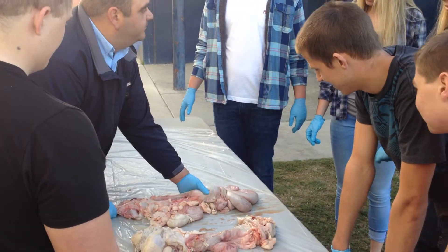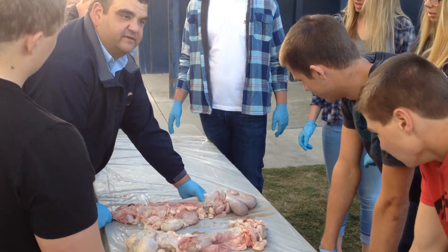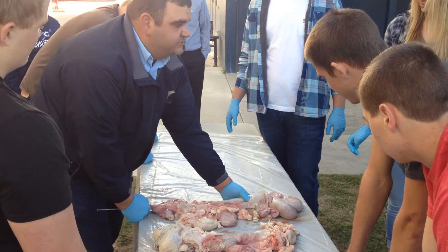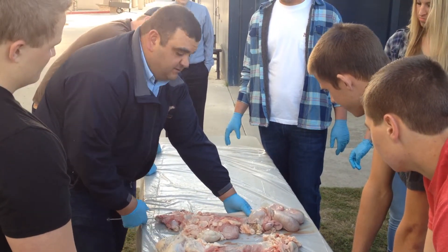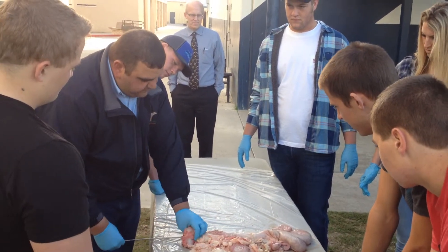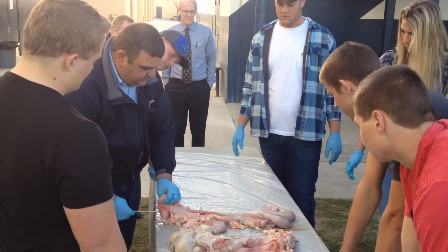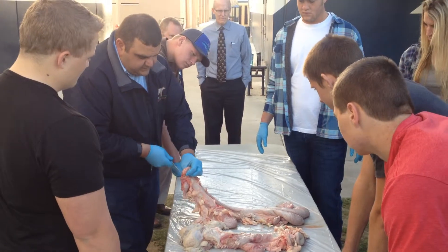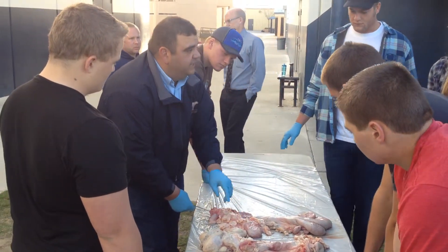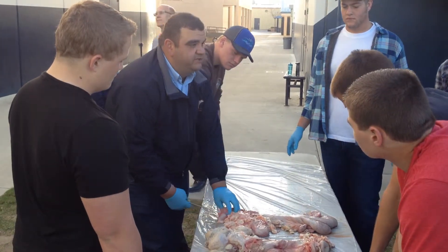You can run your thumb up behind the cervix, and I recommend that you do that on the cow. Run your thumb up behind the cervix and stretch the vagina out. Also, when you enter the tract, enter at a 45-degree angle upward, so that you don't go into the bladder. See, I'm already in the urethra right there — and that's real painful for the cow. She will kick you and she'll pee on you.